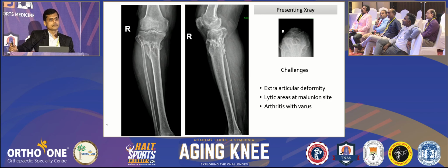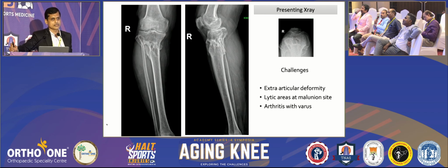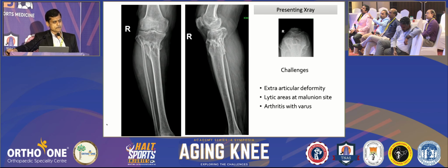Another challenge in this case is the skin condition. We have to assess it pre-operatively. All those things have been worked up, and the patient is ready for surgery. Usually they present with stiffness. Post-traumatic stiffness is a common issue. He had reasonable flexion, almost 100 degrees. When you have exposure, the risk of patellar tendon avulsion is there, so you should be a bit careful, especially in a post-traumatic arthritis. And you might have to keep a backup for an offset stem.